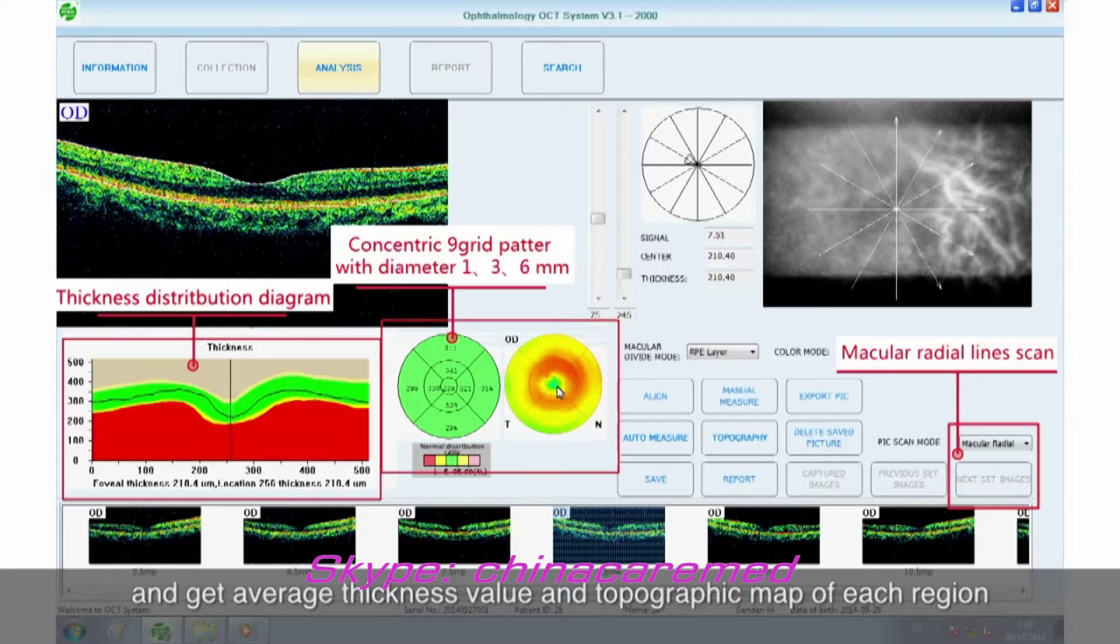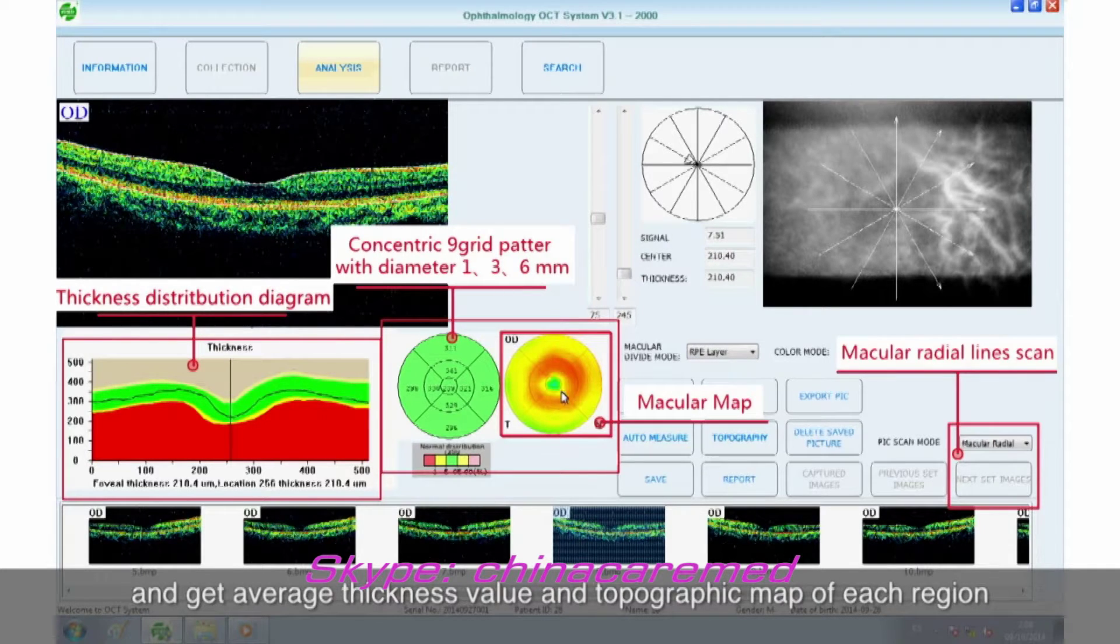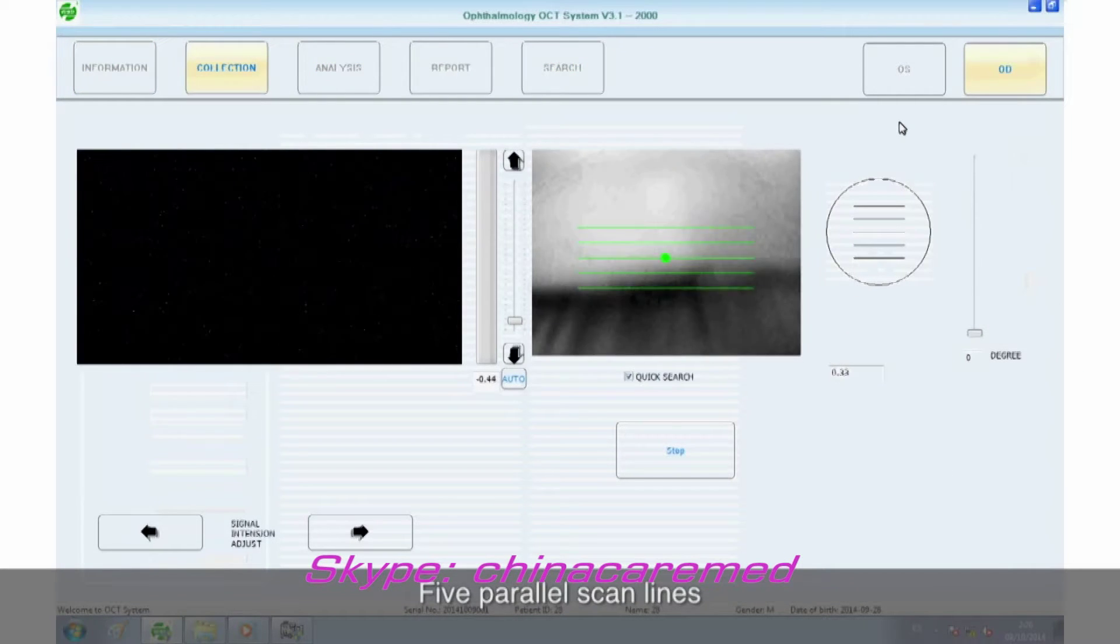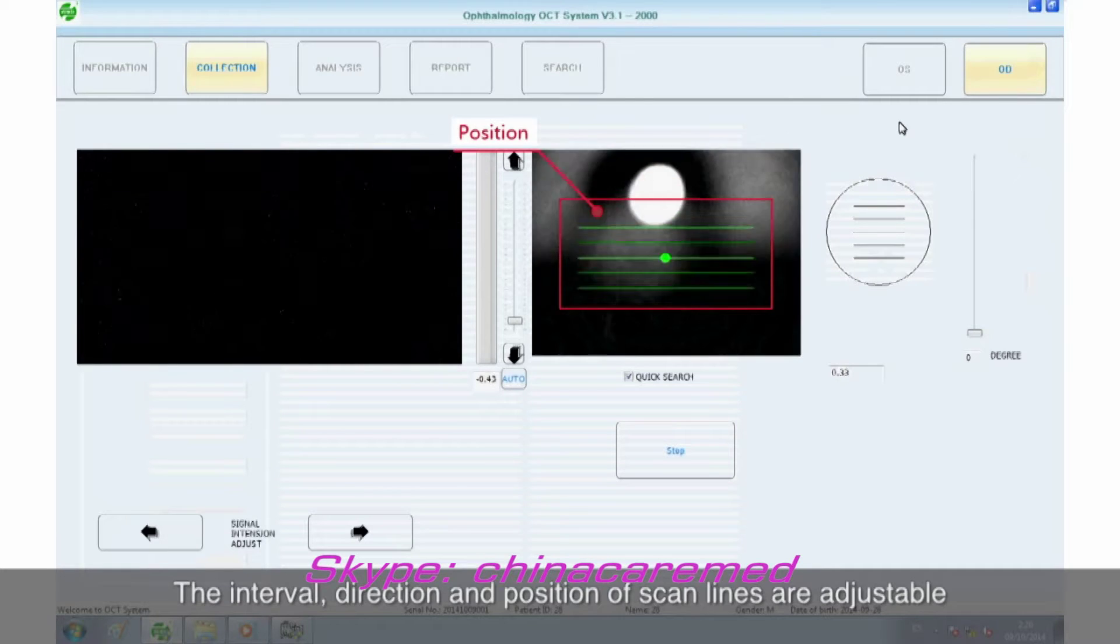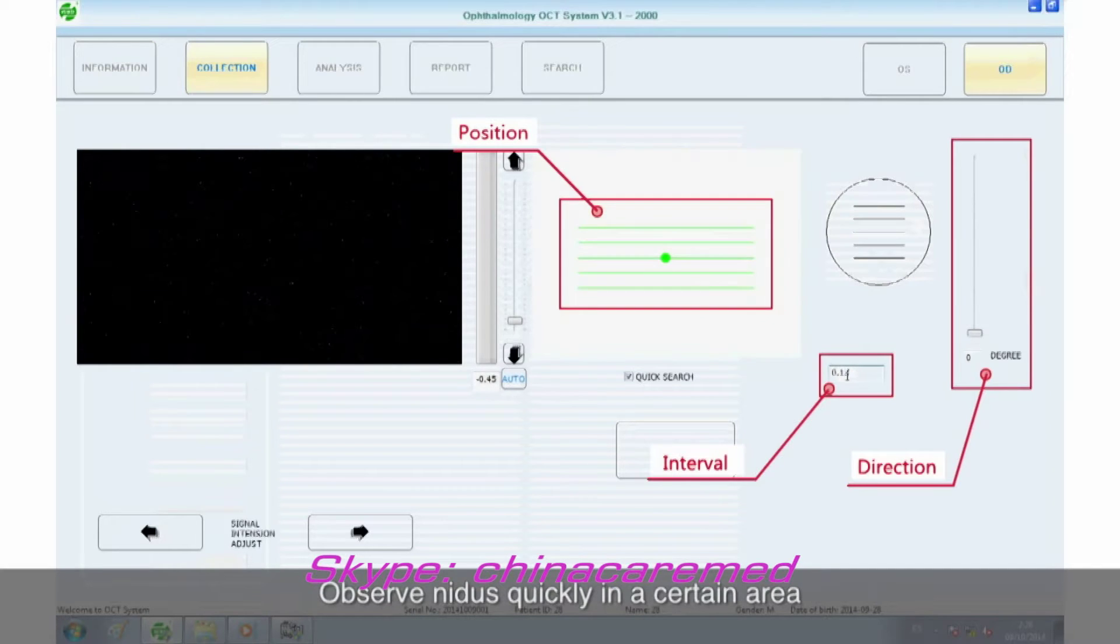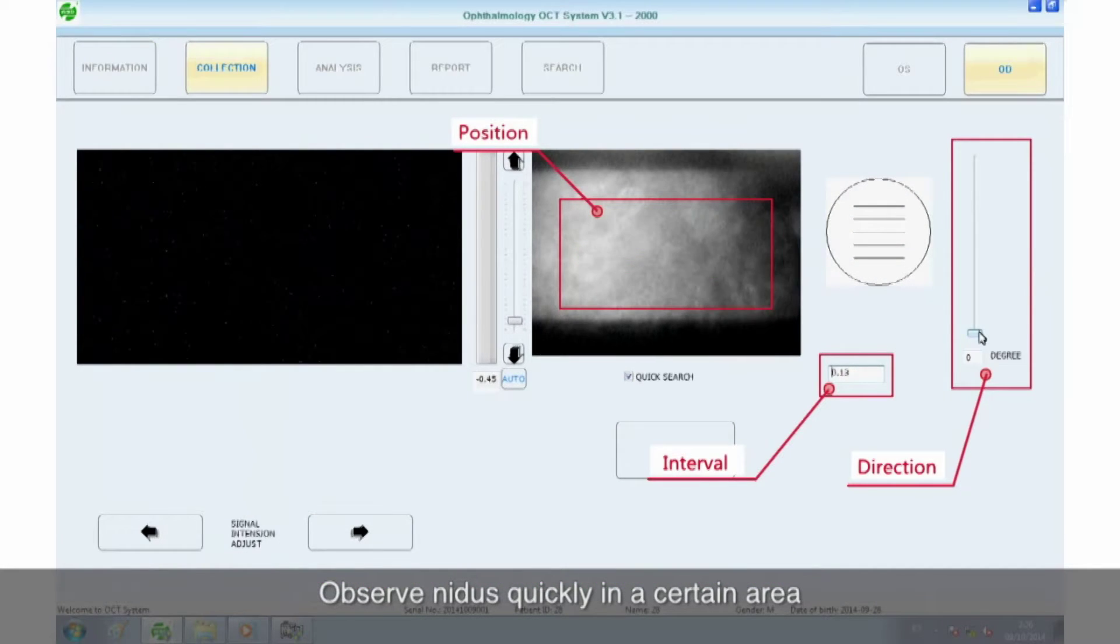Macular raster line scan. Five parallel scan lines. The interval, direction, and position of scan lines are adjustable. Observe nidus quickly in a certain area.